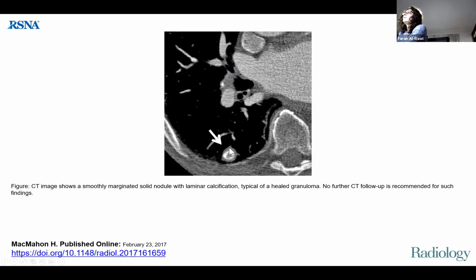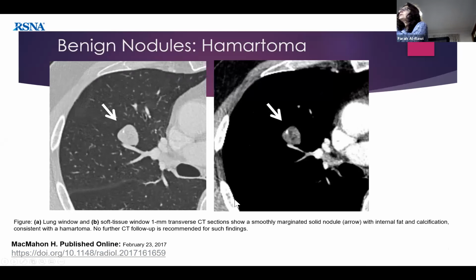This is another example of one. This one's quite big. They're usually very small, and as I said, they're usually multiple. Another benign nodule is a hamartoma. Again, this is benign. It does not grow. It does not change into cancer. What gives it away is that it's usually very well circumscribed. You can see this low density, that's fat, so it's got fat in it, and there's also calcification in it. They vary in their appearance, but when we see all these three features, we know this is a hamartoma and we do not worry about it. So whenever you hear hamartoma, again, this is something you do not have to worry about or follow up.